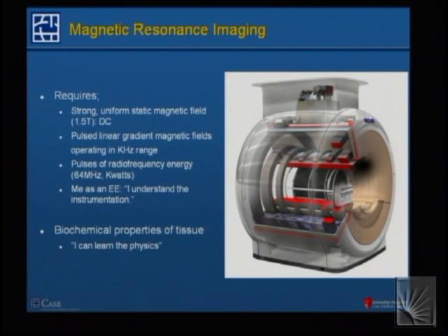And we're going to talk about why that is in just a couple seconds. This magnet that we use in MRI basically has about a 1 meter bore, so it's big enough for us to get inside of. The bore size is about twice as large as what we need to get somebody inside of it, because there's a bunch of additional electronics that I need to pack inside of the magnet before I slip the patient inside.